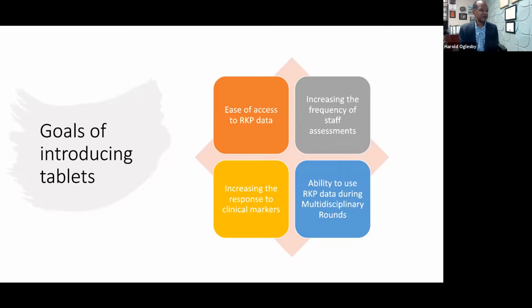And it also made it a lot easier for us to share data during multidisciplinary rounds. It was interesting to watch when the data was being shared, because when the therapists are busy, sometimes the therapist would come to rounds, but not be able to finish rounds because somebody's ET tube may not have been in the right place, or somebody may have had a leak, or something was going on. I had to take a patient to CT. But with the tablet at the multidisciplinary rounds, they could put up all the information and look quick, fast, in a hurry and assess patients.